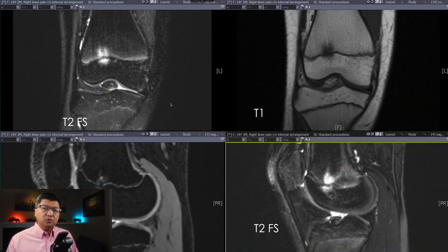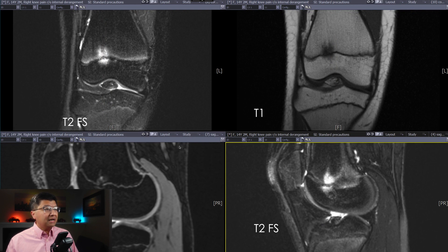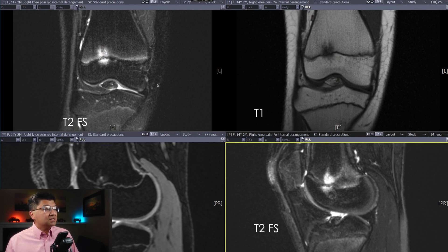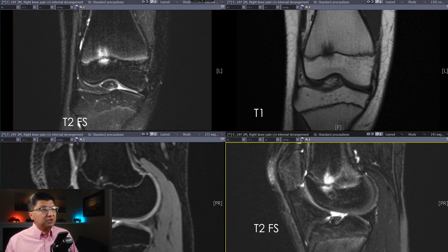So let's go on with our first case. This is a 12-year-old girl who came in with knee pain. We have four MR images for you. In the upper left-hand corner is a T2 fat-saturated sequence — you can just call this a fat-suppressed, fluid-sensitive sequence.